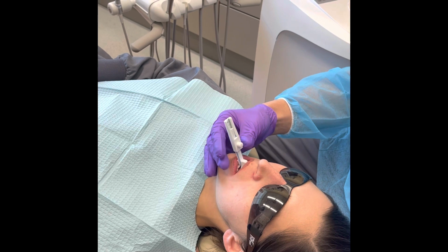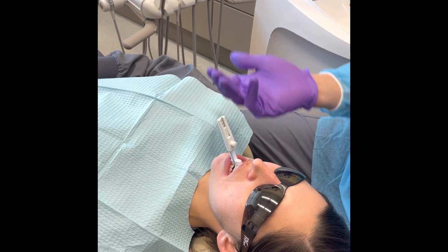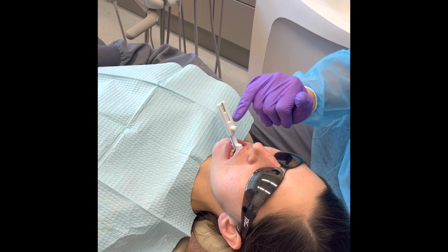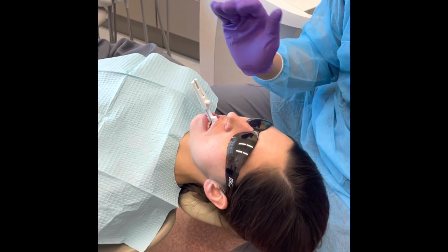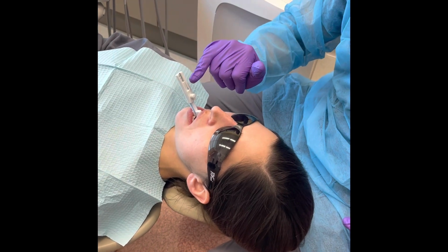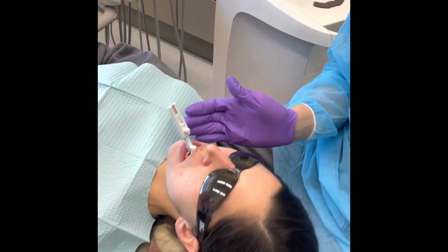Because this is a little bit beyond edge to edge. We still have 3 millimeters of movement, so we're not going to bring you to 100. Even if we bring it all the way, we'll still be about 80 to 85% maximum protrusion in our initial ProSomnus setup if we take our initial tray 0 at this position.